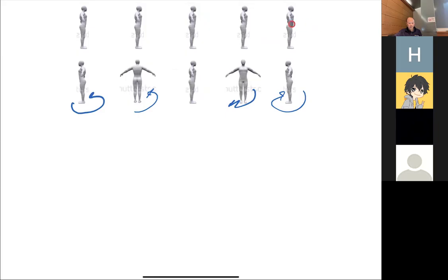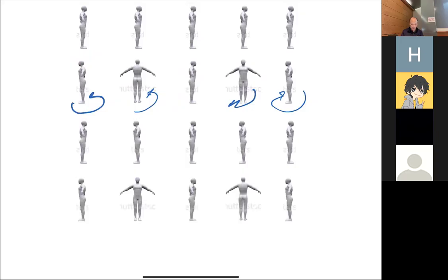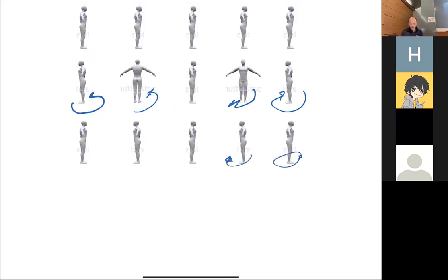But what you're seeing here is that if I just look at this one increment of time, I start seeing an interesting pattern. You could almost start imagining a sinusoid here, right, this variation. And I go to the next step, and this person has gone yet another 90 degrees. This person has gone another 180 degrees, and so on and so forth. You notice here, the pattern is different, right? So the question is, which of these has a higher spatial frequency in terms of variation? Does this have a higher spatial frequency or does this?